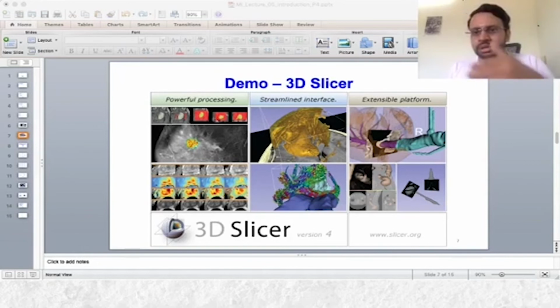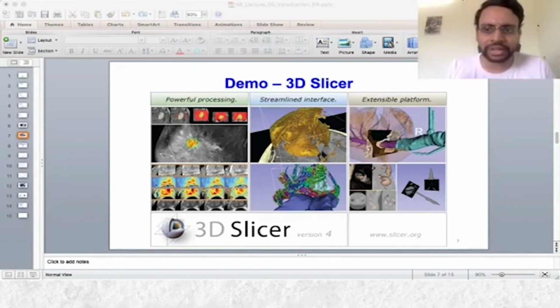For example, thresholding, there are various filters for thresholding based segmentation, edge detection, and then intensity mappings. You want to find out the gradients, then second order derivatives, neighborhood filters, smoothing filters, blurring based filters, edge preserving smoothing you want to do, and a lot of things, geometric transformations you would like to do.